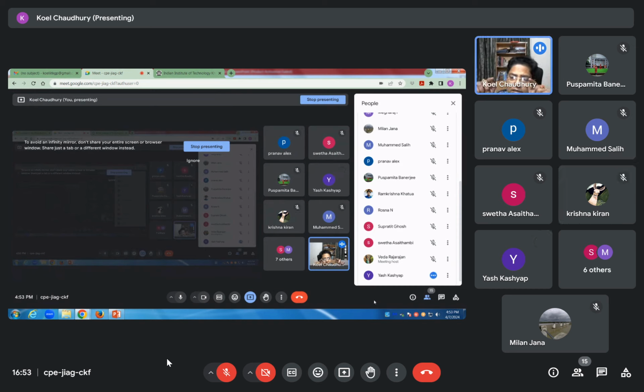The first MR sequence, I use the gradient G naught. Second MR sequence, I use G naught plus 1. A little steeper I make it. Third MR sequence for the same slice, I use G naught plus 2. So it keeps on making it steeper, because then only you can fill up all the data. I'll come to why you keep on increasing, we'll understand. So are you a little clear about this? You have to read it up.